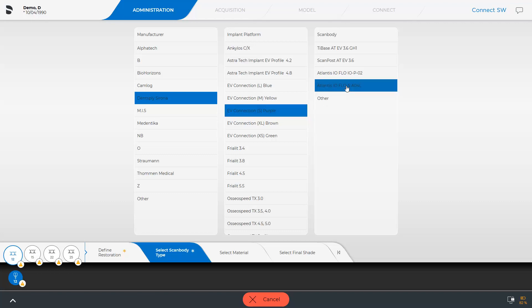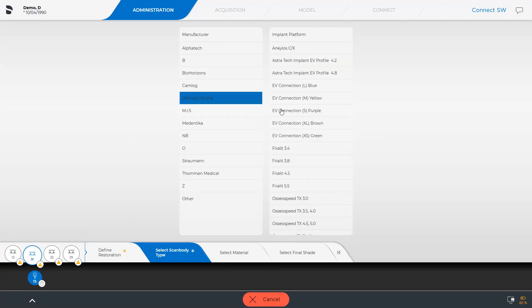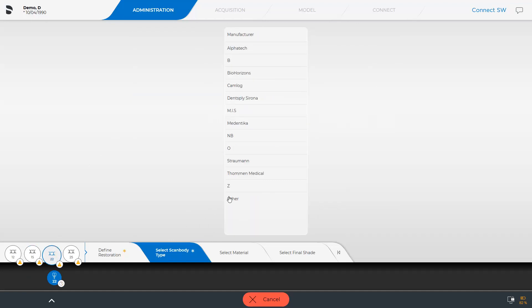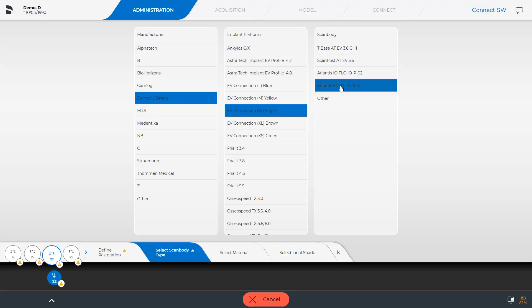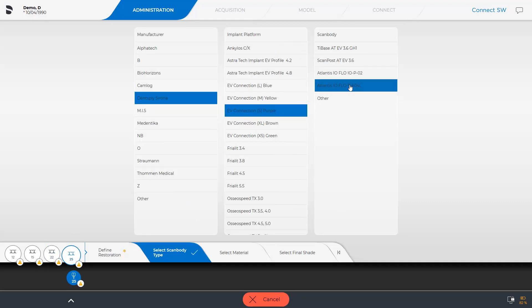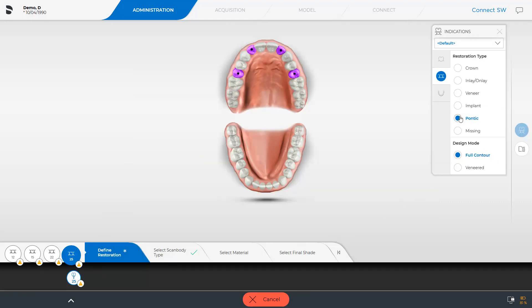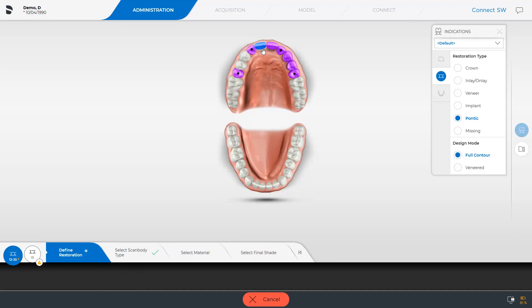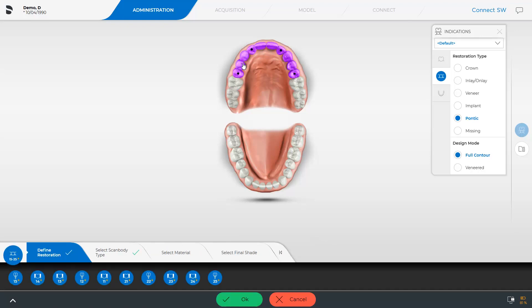Next, we make the same selection for the remaining three implant positions. Since we still need to define the pontics, we go back to the Define Restoration step and enable the pontic option. Just like before, we mark the pontic positions in the odontogram, and are now able to confirm our upper jaw selection by tapping OK.